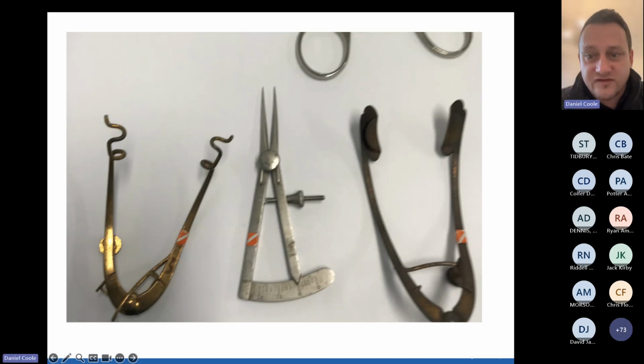Tape is a big no-no for me. It's a great way of identifying instruments, but if some of that tape peels off, then you're potentially in surgery. That area of the device isn't sterile, so that's a big no-no. Bugs can sit under it. It's just not a great thing for the cleanliness of the device.